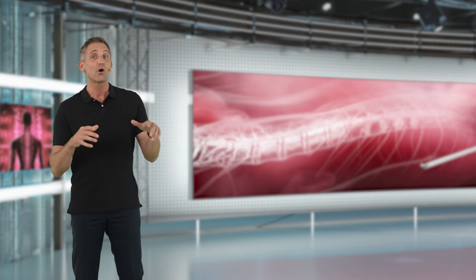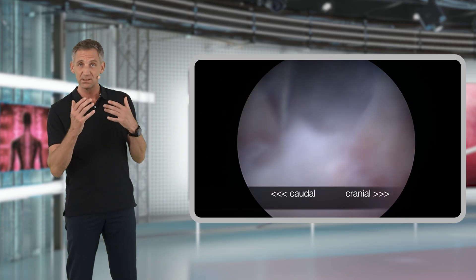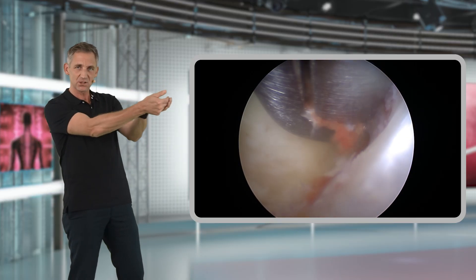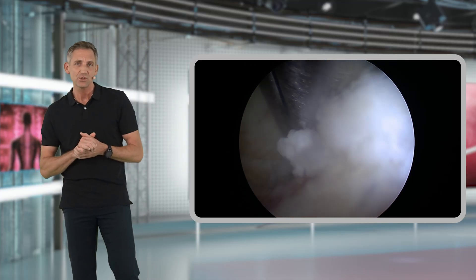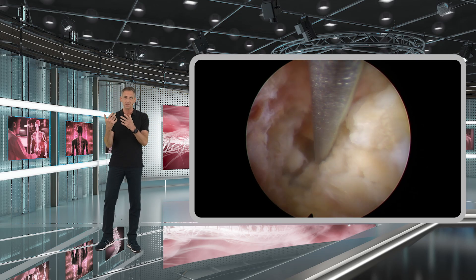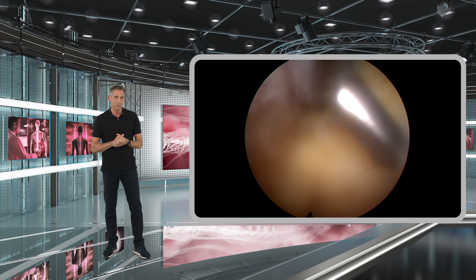This is however not my preferred strategy in spinal stenosis. In the vast majority of spinal stenosis cases, I extend my decompression cranially until we reach the insertion of the yellow ligament right underneath the cranial lamina, and then I detach the yellow ligament there. You can see during surgery that you are getting closer to this cranial insertion site as the yellow ligament becomes thinner and thinner. From here you can pull the ligament caudally and remove it with sharp scissors or Kerrison punches.